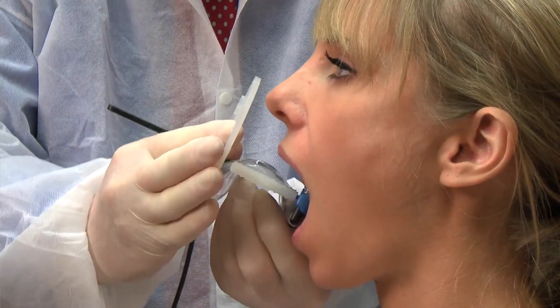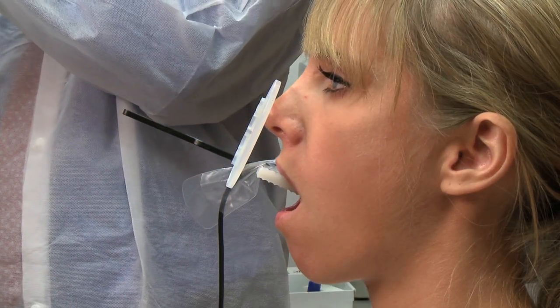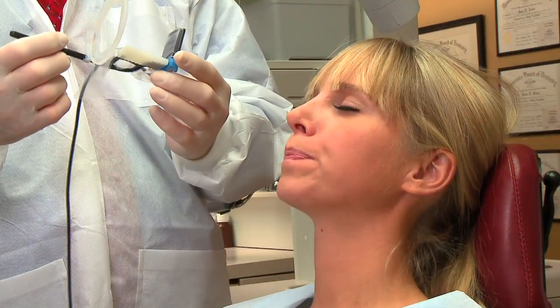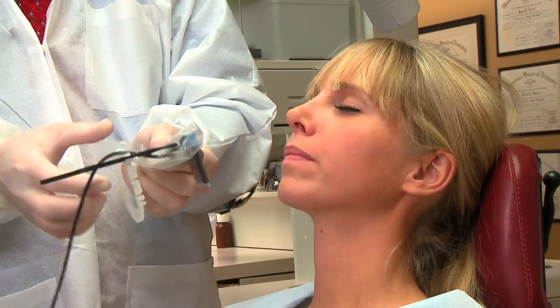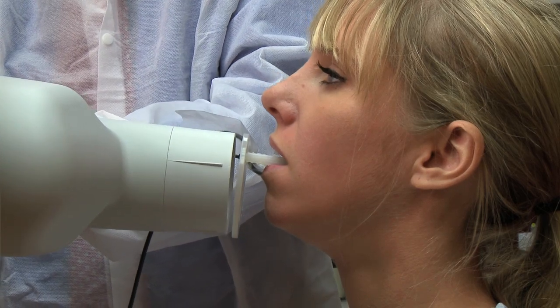Put the sensor as posterior as possible in the patient's mouth. The bite block gives a steady support, resting on the incisal edge of the maxillary teeth. Position the cone and take the image. Without changing anything, just rotate the holder to get the lowers. Position the sensor with the bite block resting on the incisal edge of the mandibular teeth. Tell the patient to close gently. Align the cone with the aiming ring and take the X-ray.